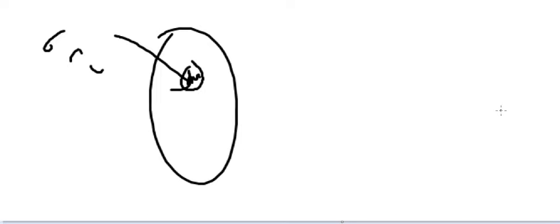According to this, we know water is 0 Hounsfield unit, bone is 1000, and air is minus 1000. What about fat? How much do you think? In the minus or the plus? It will be in the minus. Fat is less dense than water. Oil floats on water, right? Fat floats on the water. It's less dense, so it will be in the minus, less than 0. How much less? Around minus 50, 60, 70. Okay?